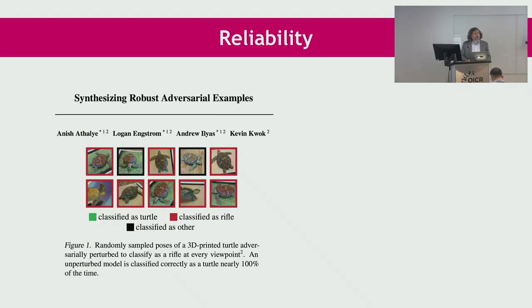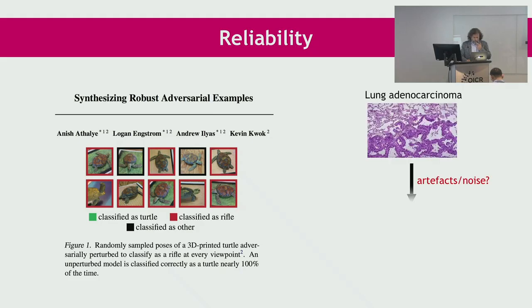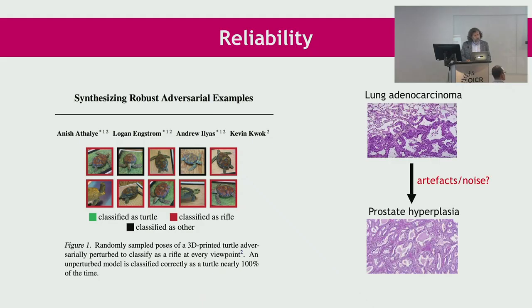Okay. Don't we have site information when the pathologist is receiving the digital images? Because this case, it's lung versus prostate. So definitely we do, but if we give full control to AI and AI makes some mistakes and it is not supervised, then things can go wrong. And this is something that, even if we ignore it, regulatory bodies will look into. So we have additional information.